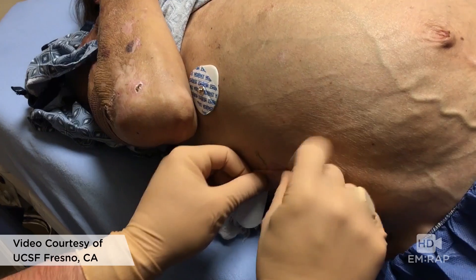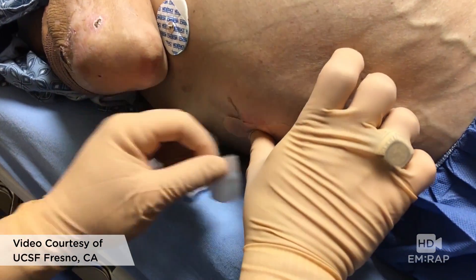Remove the catheter, place a dressing, and you are done. I'm Dr. Jess Mason.